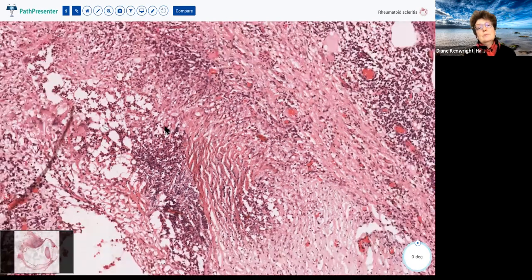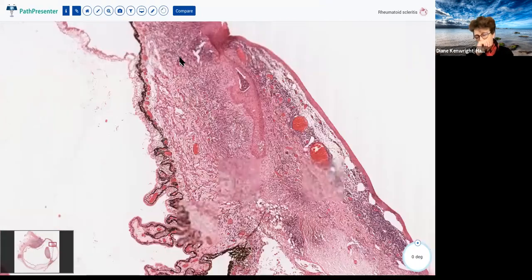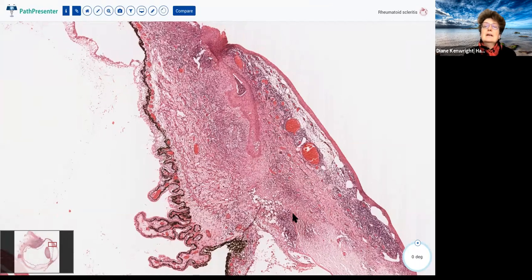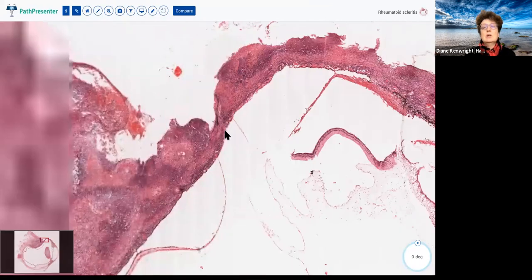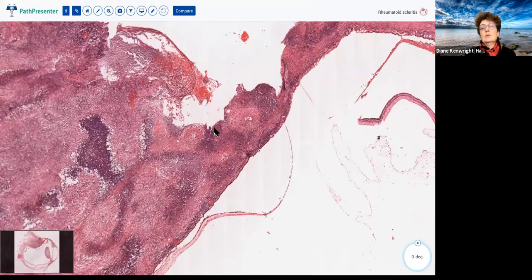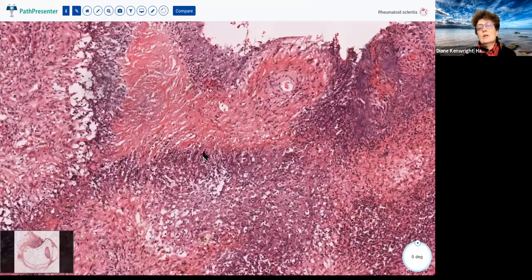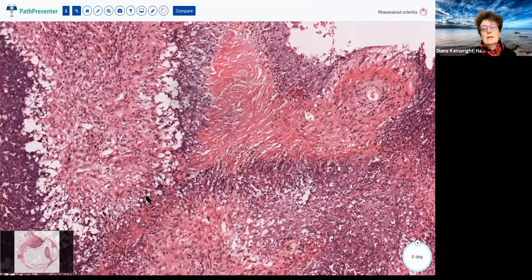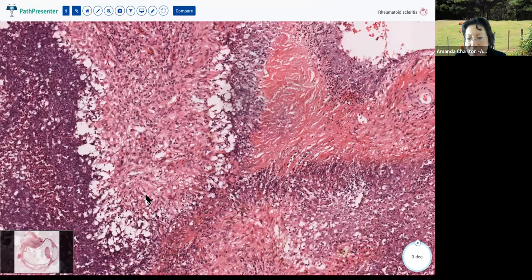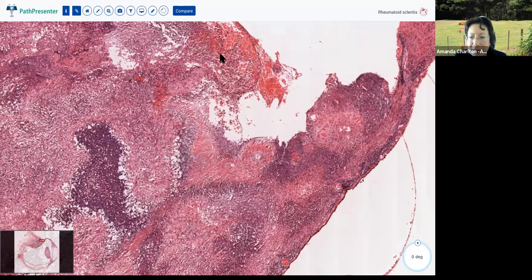For me, I was really interested to watch the teams making the differential diagnosis here. They knew it was inflammation, and then were thinking whether or not it was bacterial inflammation or inflammation associated with collagen vascular disease. And the trick was recognizing the dead collagen and this kind of ring-shaped inflammation around it that is granulomatous inflammation. Here's a whole lot of granulomatous inflammation here. That's a really nice line of epithelioid histiocytes. Can you put it at the edge of that necrobiotic granuloma?